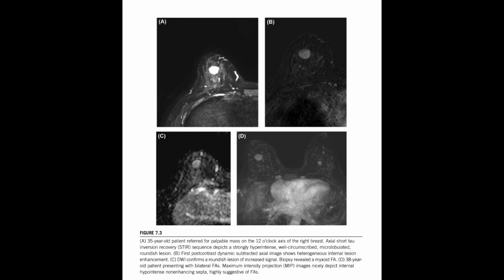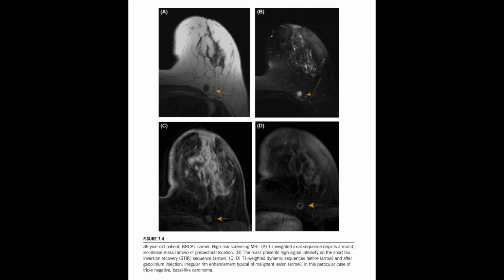So are there any super specific signs, like a visual signature for the most common benign finding, the fibroadenoma? There is, and it's a beautiful, really specific descriptor. If you have a mass that already has that benign shape and margin. Round, smooth? Right. And you also see what we call dark internal septations. That is highly, highly characteristic of a fibroadenoma, or FA. Dark internal septations. So that's like non-enhancing lines or stripes cutting through it. Precisely. They're little fibrous bands that don't take up the contrast agent. It's a classic memorable sign, a real high-value piece of information. That's a powerful shortcut. Round, smooth, you see those dark lines?